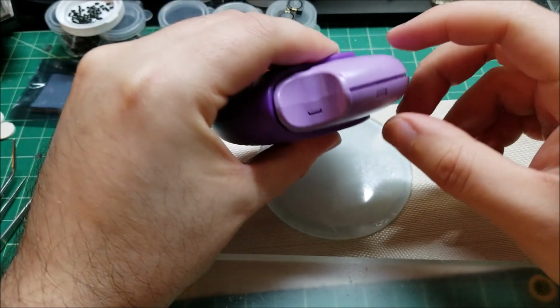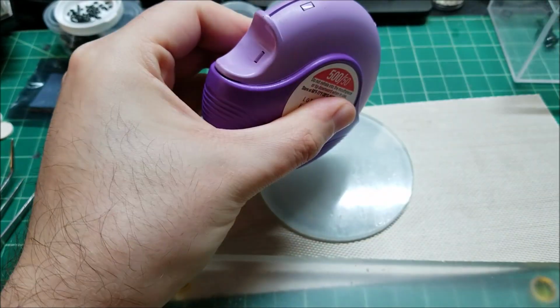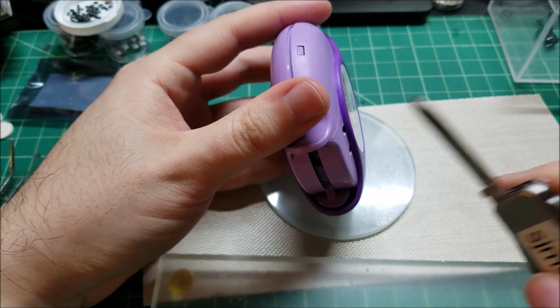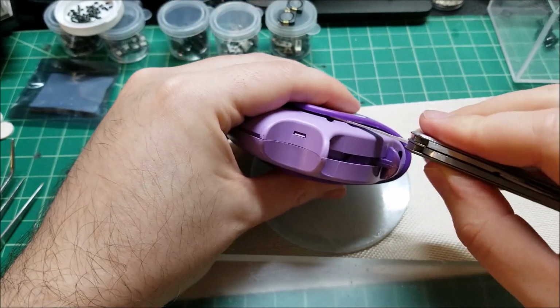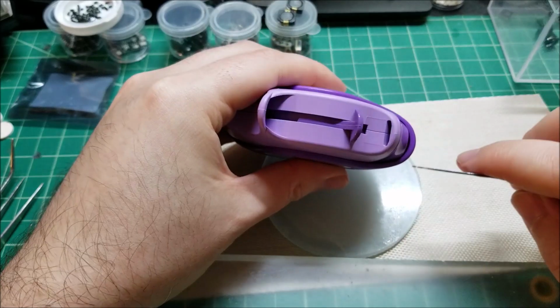There's like a grippy kind of... It's very ergonomically designed, I will say. That's very interesting. Anyway, to get this open, the easiest way is you partially open it so that you can see these little notches, and you have to get 2 blades in on either side. Now, on this side, it's pretty easy. This side requires a little more work.